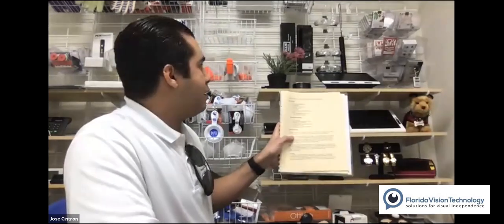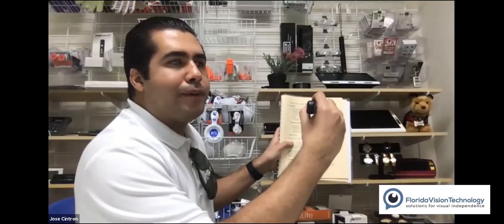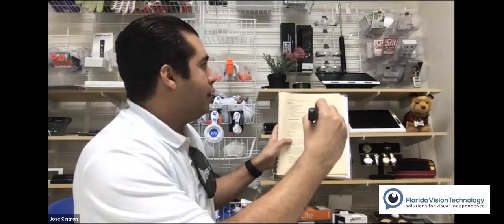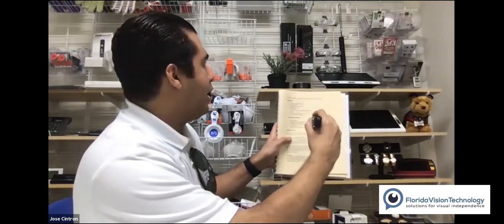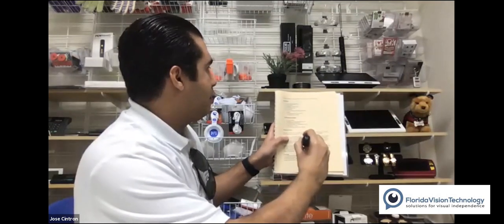Michelle, you can see the recipe? Yes. Okay, so I'm going to hold up the OrCam, and this time, instead of just single pressing that trigger button to take a picture, I'm going to press and hold the trigger button to put the laser on the screen or onto my document, and you should be able to see it. Let's see, I'm going to put it right there, release it.